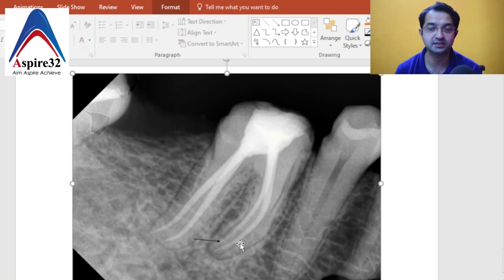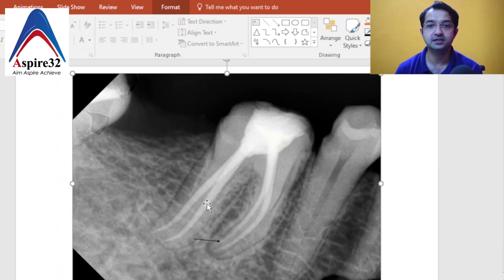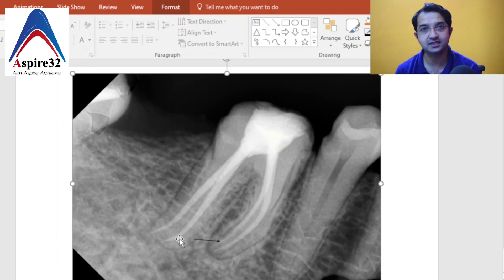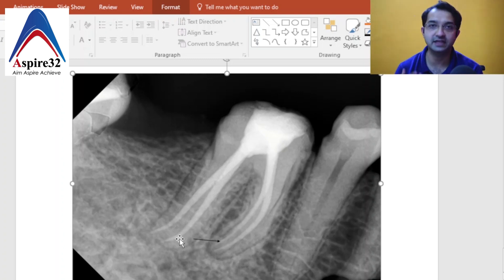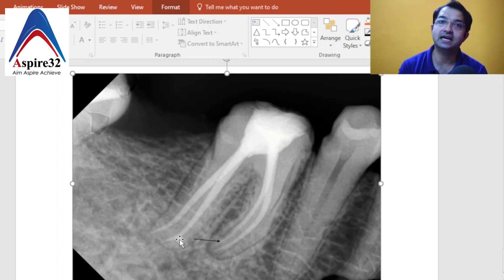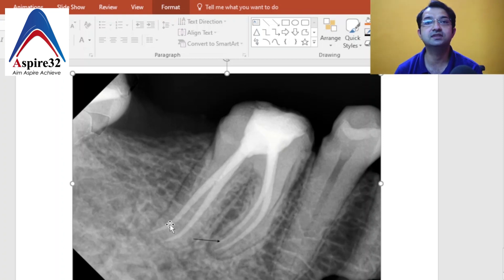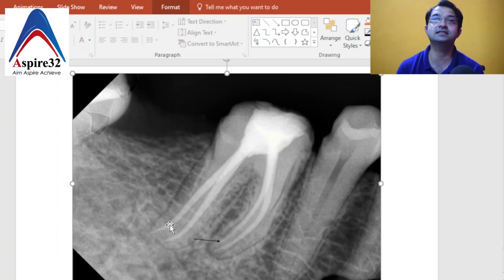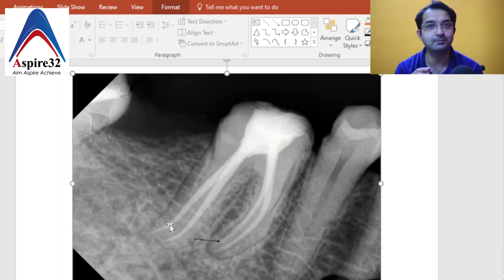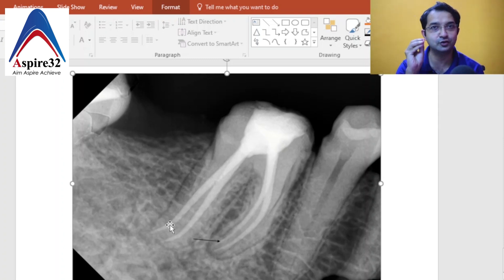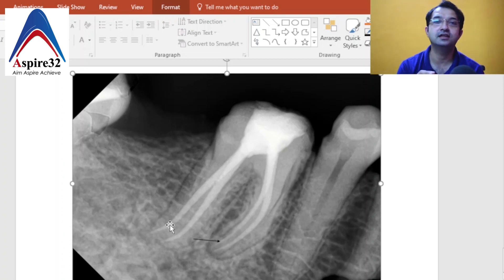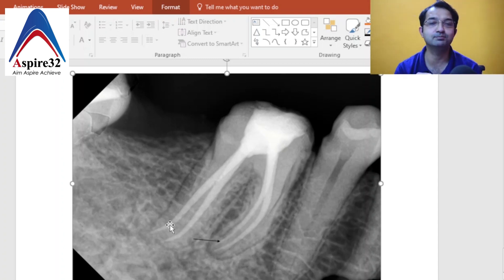In the same way, in the distal root, the canal which appears mesial (front) is the disto-lingual canal, and the canal which appears most distal is the buccal canal — making it the disto-buccal canal. This may appear a bit confusing at first, but try to revise and follow this MBD rule and most of your treatment becomes very simple without needing extra files of different configurations for diagnosis.